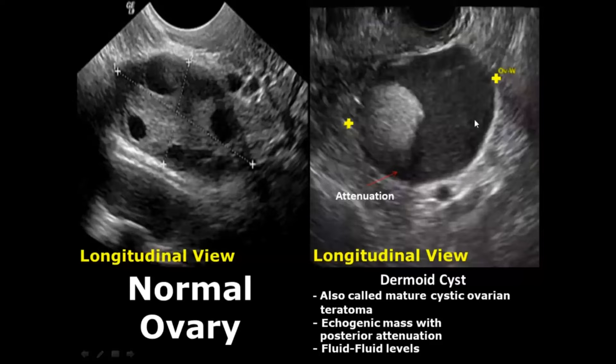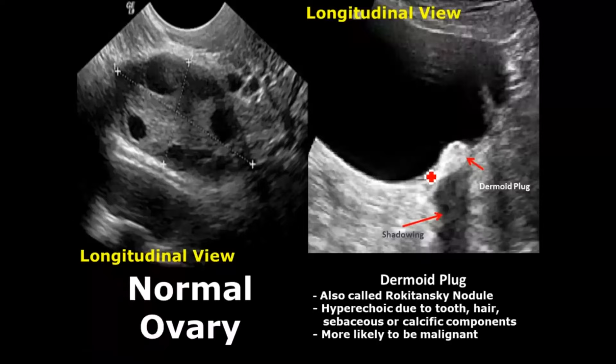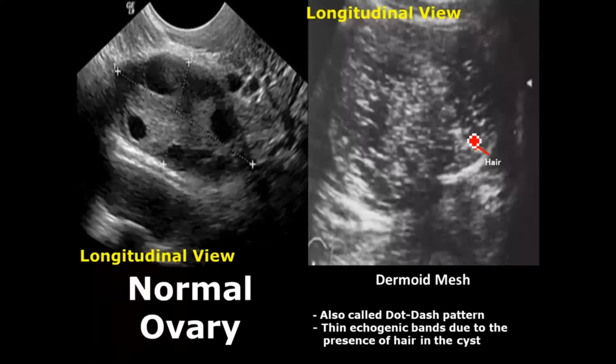Mature cystic teratomas are also called dermoid cysts — they are echogenic masses with attenuation and fluid-fluid levels from two different fluids with different densities. The dermoid plug, also called the Rokitansky nodule, is a hyperechoic structure due to hair, tooth, sebaceous, or calcific components. The dermoid mesh gives a dot-dash pattern from thin echogenic bands.